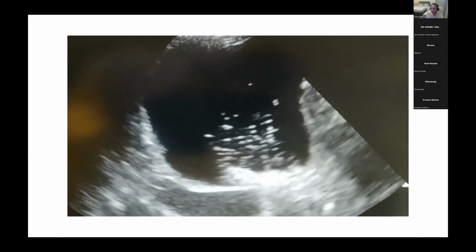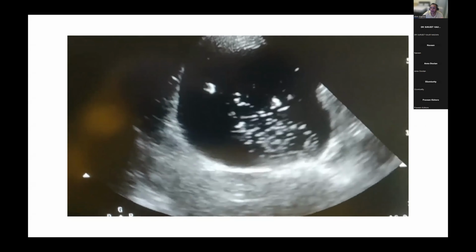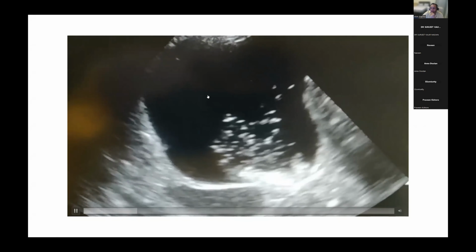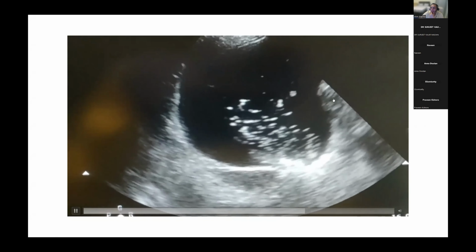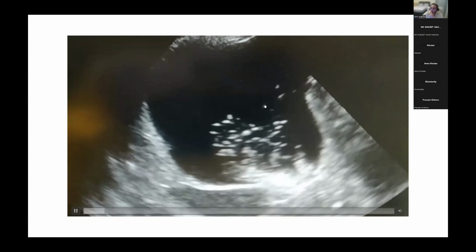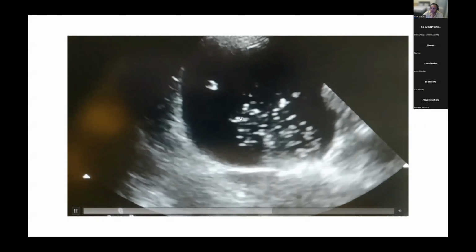Acute bleeding, it's echoic probably? No, it'll be anechoic. No? Fluid is anechoic. Okay. It will allow sound waves to go through. You might, after a while, have sedimentation, but really from your perspective, fluid would be anechoic. So if this was acute bleeding, it would still be anechoic, maybe with slightly different densities of anechoicness. But here you've got brightness.